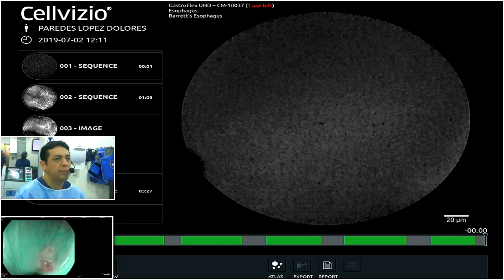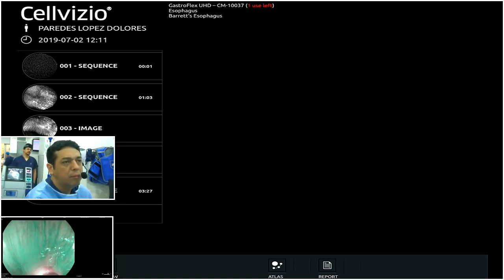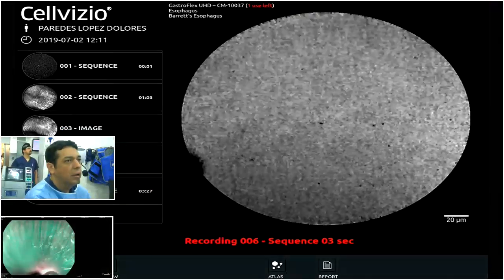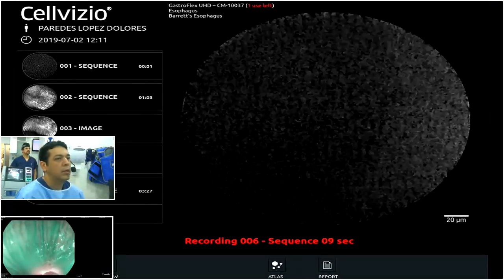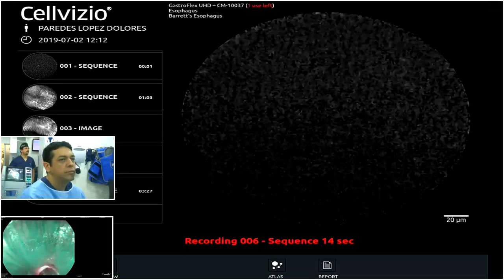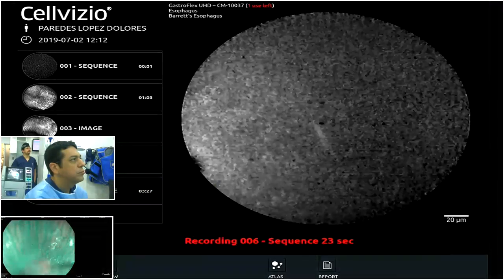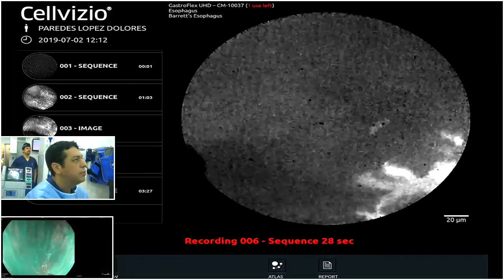Okay, we will see this area now. A little bit difficult.